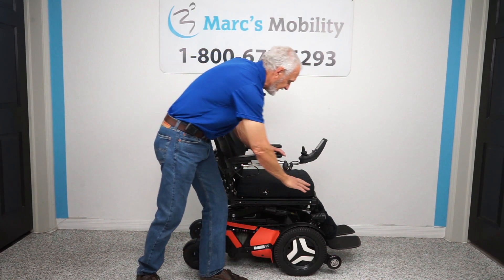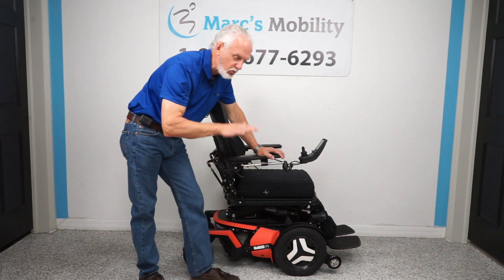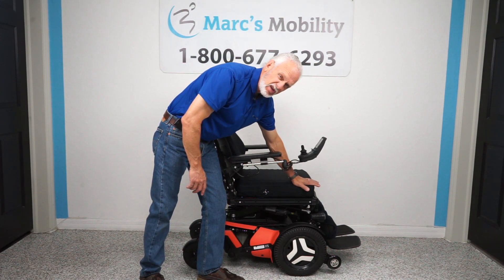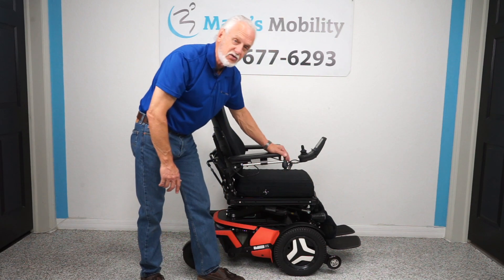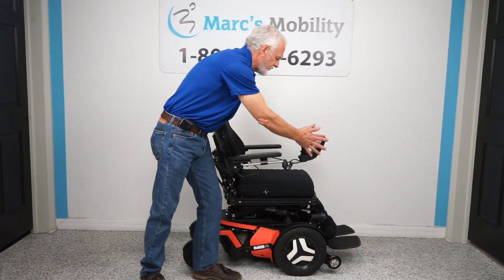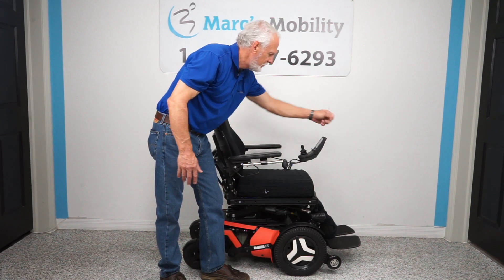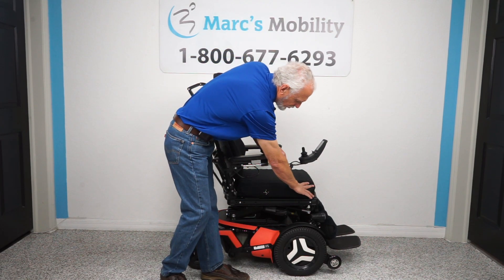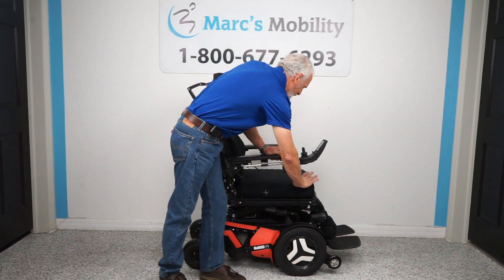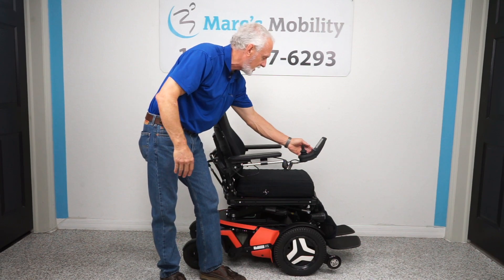Right now the seat is sitting at 24 inches off the ground — we can make it 22 if you need it dropped down two more inches. Starting at 24 inches, if you add 14 inches you'll be at 36 inches high — eye level talking to someone standing in front of you.